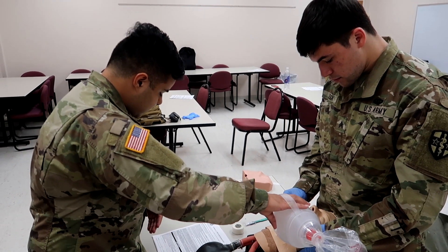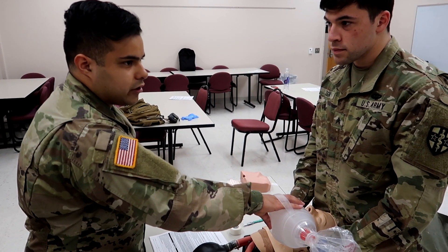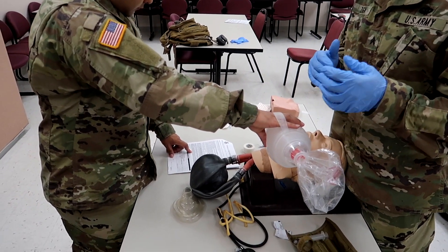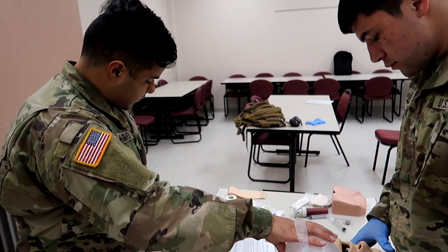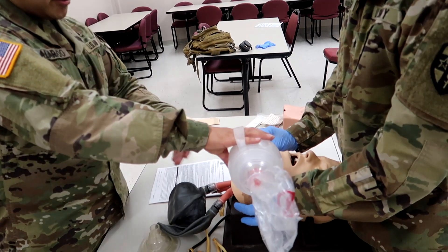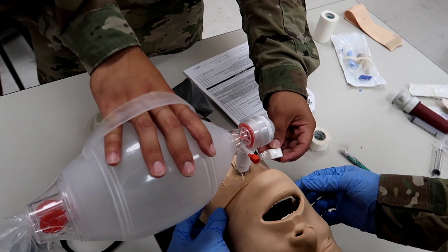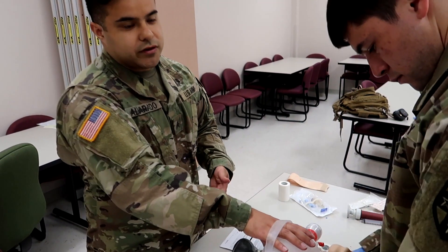The evaluator is going to say you hear nine respirations. So if I hear nine respirations, I'm just going to leave him — he can be assisted with ventilations but does not need to have someone breathe for him. Now he's going to apply dressing around the tube, grab any gauze, secure the tube, and secure it with tape or strings around the neck.